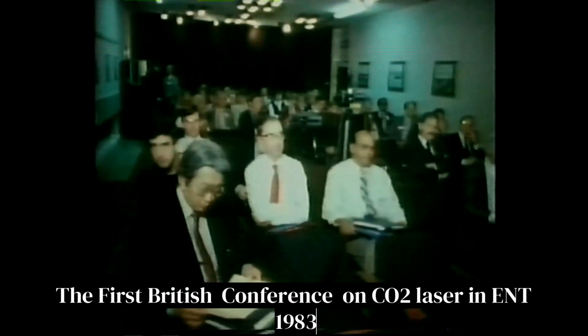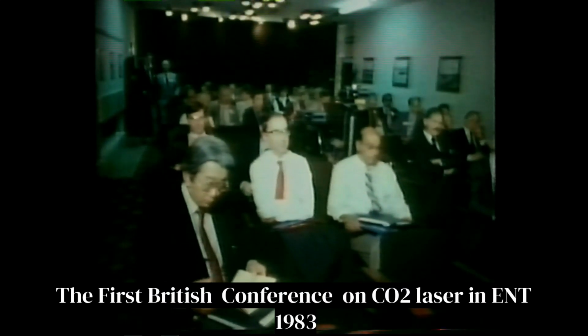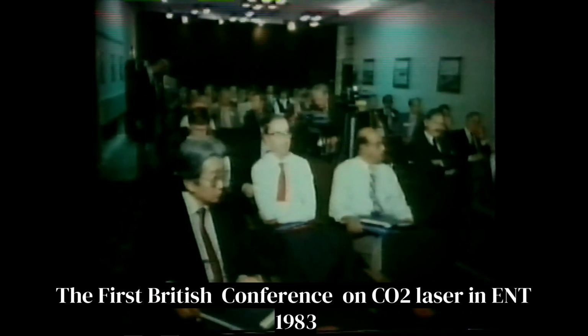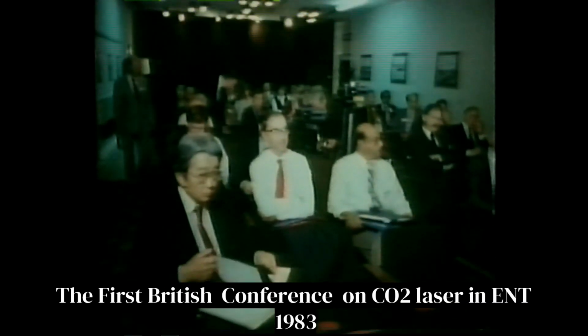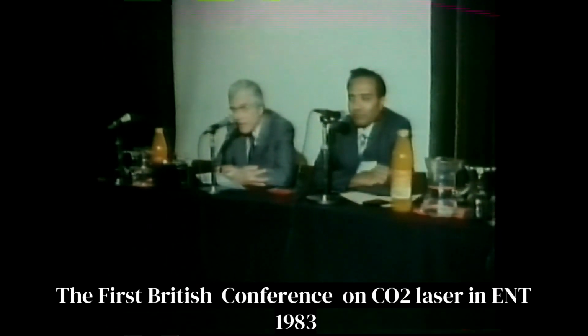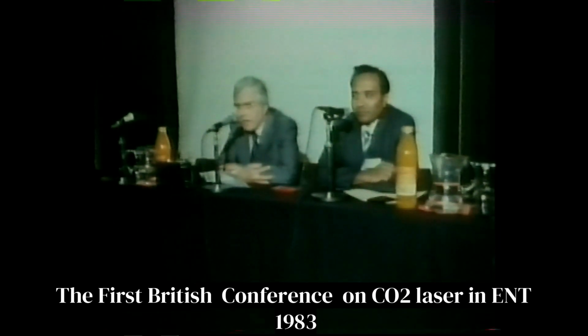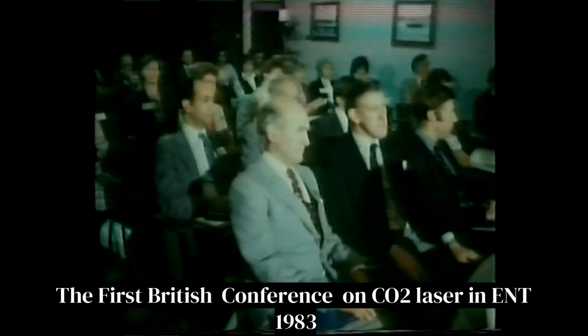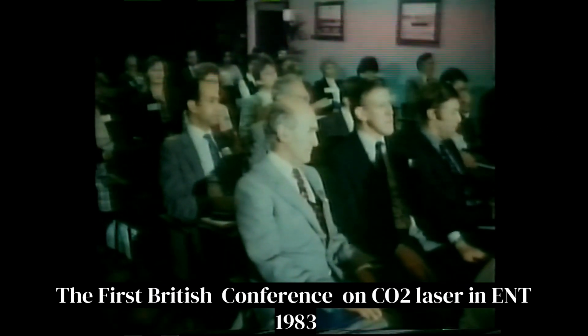If this tool is new, I think we should find out what exactly it does and what exactly it cannot do. Therefore, the objective of the conference is to discuss and share our experiences with people from the rest of this country or Europe and America. And at the end of the day, I hope that this particular tool will find its rightful place in the armamentarium that we have to deal with cases of cancer or any other lesions in the mouth and larynx.